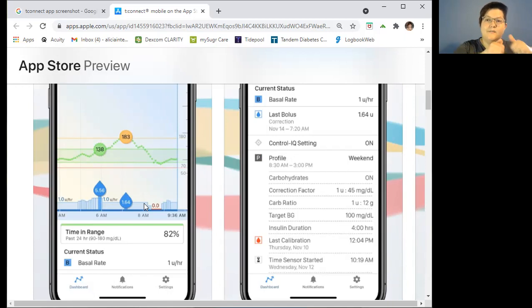So I put in my blood sugar, put in my carbs, get my recommended dose, and I can tap that and pretty safely add a 0.5 to make up for the basal that I missed. If my blood sugar is not dropping too far, I can also give it a little extra pre-bolus time, because I know I'm going to lift up a lot higher than usual, so I can let my insulin get acting a little bit more before that happens. In this particular case, at that time of day, I was coming down close to a 70. I don't know how much extra pre-bolus I want to add on to that, but it's an option, and it's really good to know we have that option.